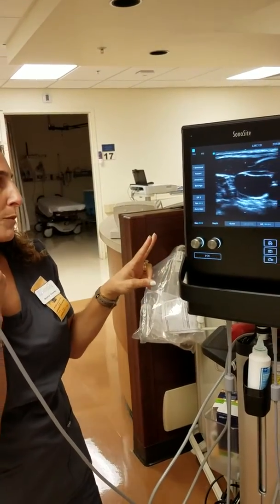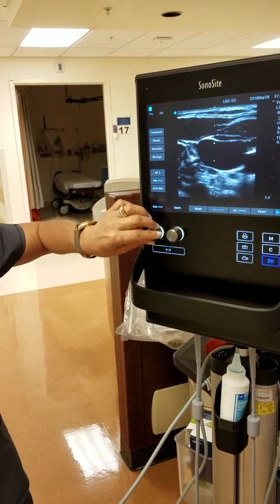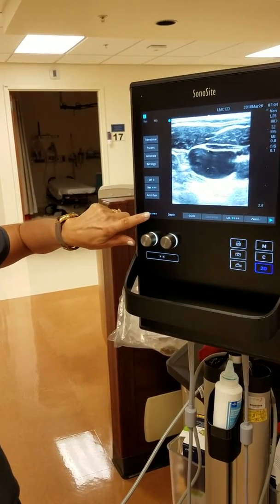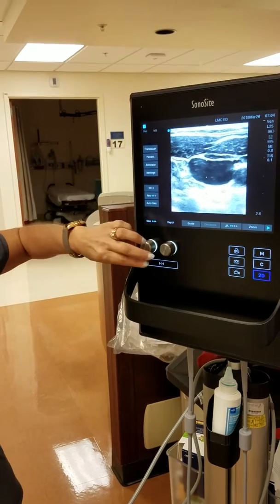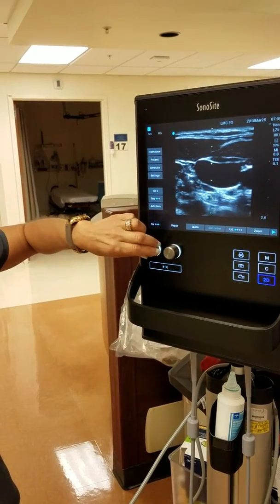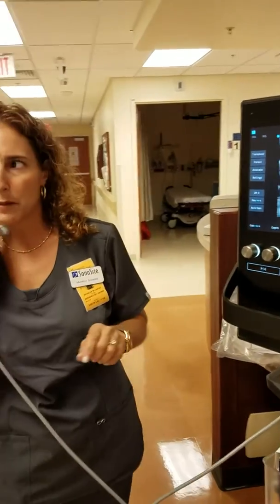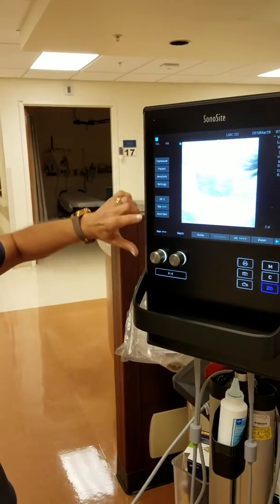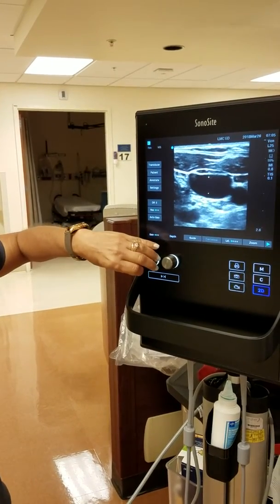Your two knobs right here — this is your gains. This is your most important button. Your gains control the overall brightness of your image. If you tap it once, it says 'near,' which is the near field — the top half of your screen. If you tap it a second time, it says 'far,' which is the bottom half of your screen or far field. Tap it a third time and it goes back to overall gain. Most people will use the overall gain. You also have auto gain — if the image is too bright or too dark, hit auto gain and then adjust it to however you like it.